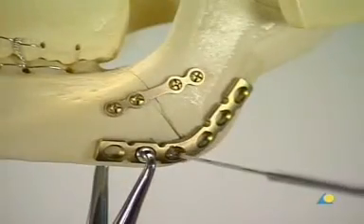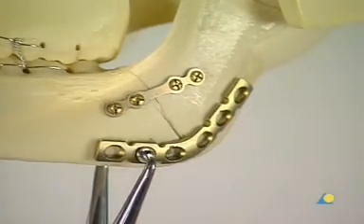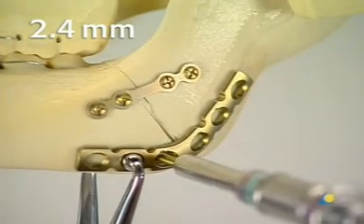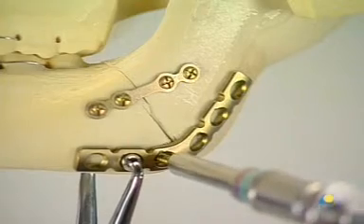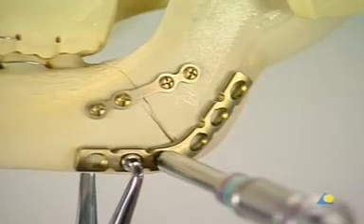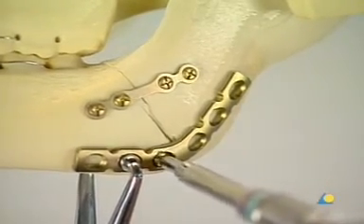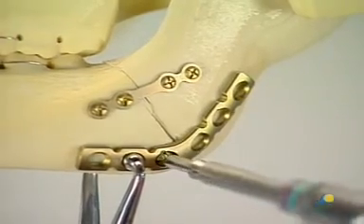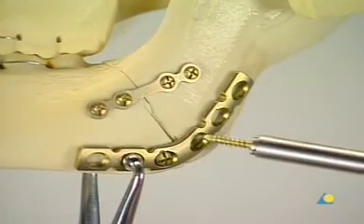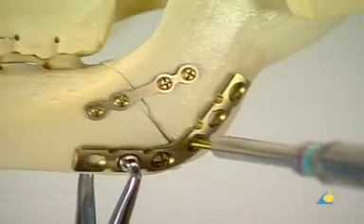The depth is measured with the depth gauge. A 2.4 mm self-tapping screw of appropriate length is inserted. If the bone is very dense, the hole may have to be pre-tapped. Another neutral screw is inserted in the other main fragment at a safe distance from the fracture.